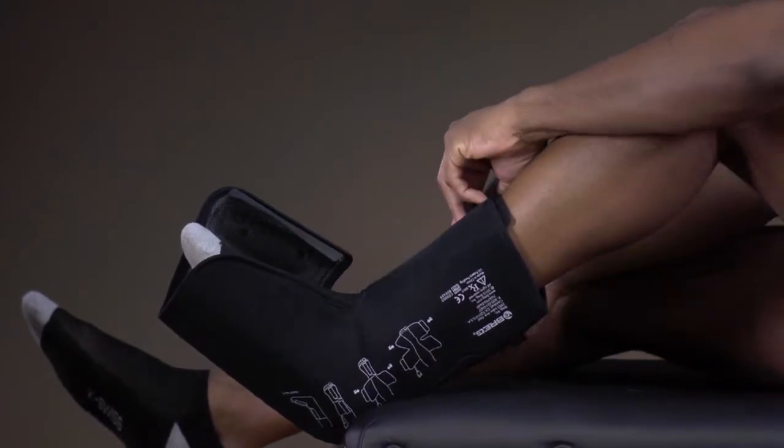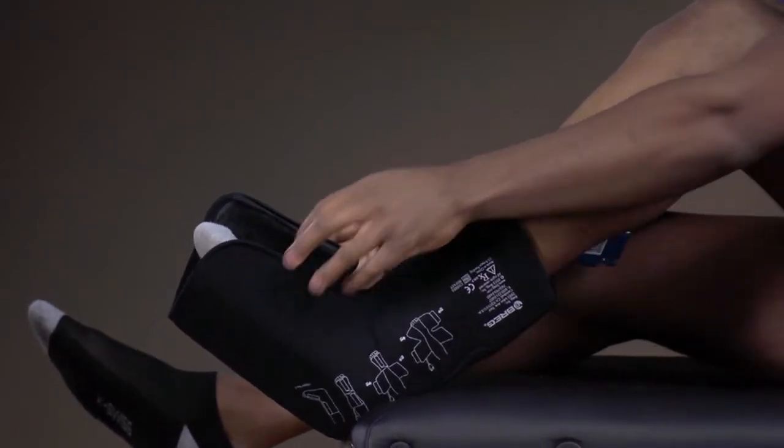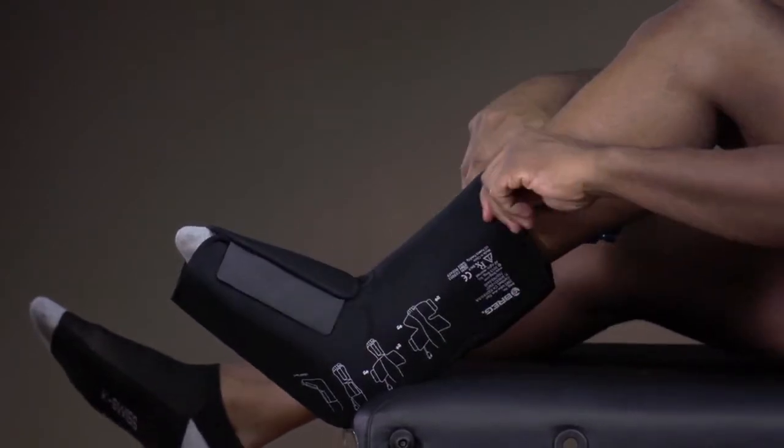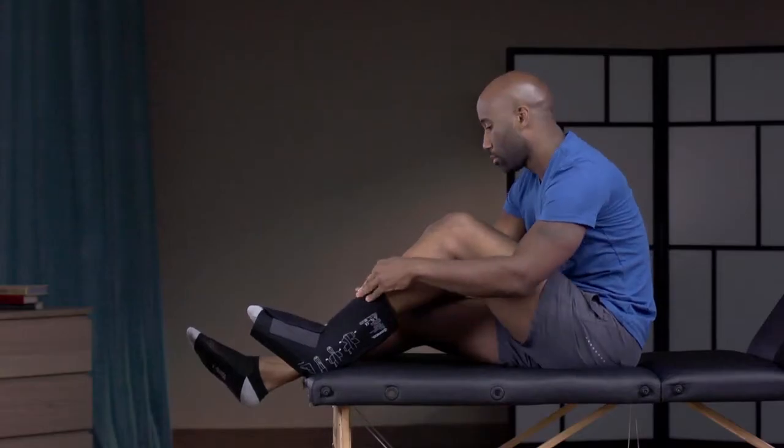Take the strap located at the top and secure it across the calf. Then repeat the same action with the strap that secures the foot. Tighten the strap so the pad is secure.